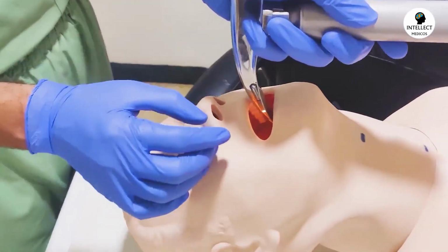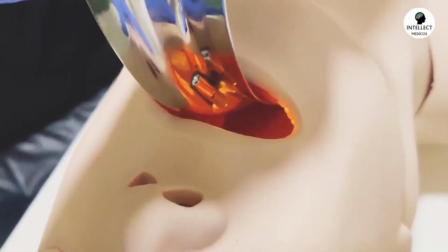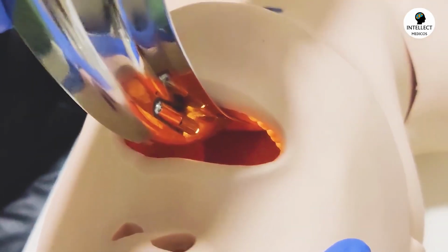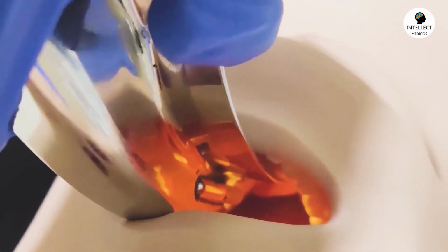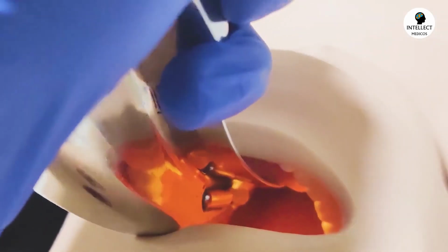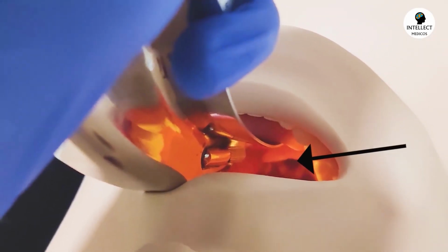Now come on to the inside of the mouth. Now I'm inside. As you can see, there is the tongue which I have deviated from right to left. Now I'm going inside. I'm going inside till I see the epiglottis. So you have to go gradually. I'll show you. Yeah. So this structure which you can see over here is the epiglottis. And once you see the epiglottis, you just have to give a pressure. Can you see? You just have to give a pressure and you can see the vocal cords over there.